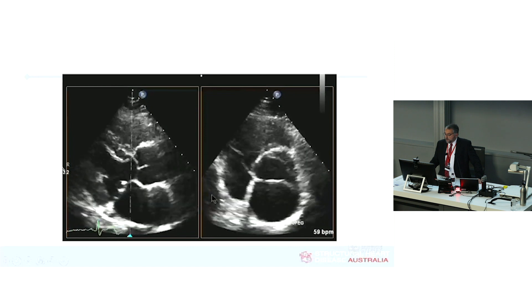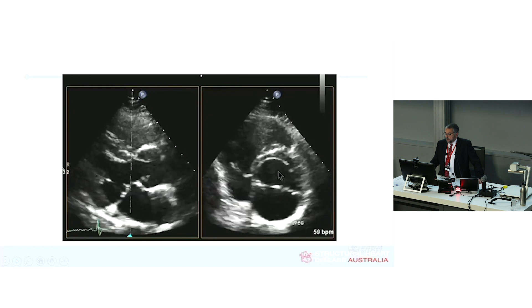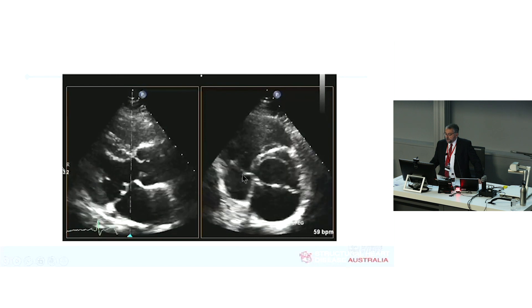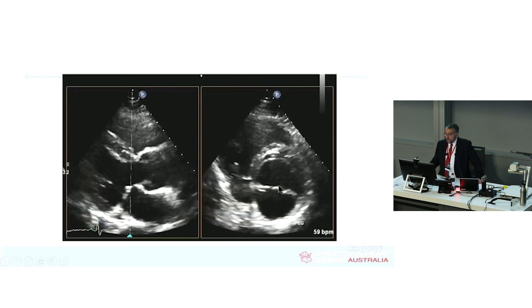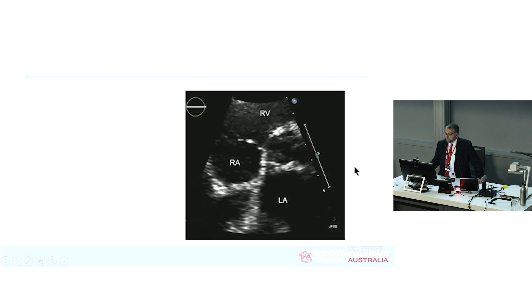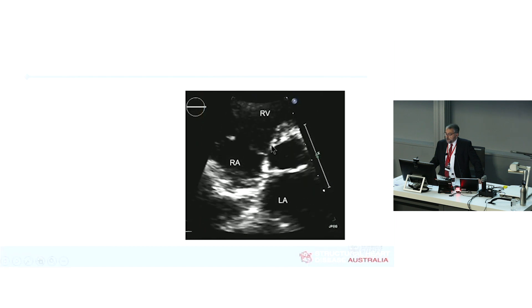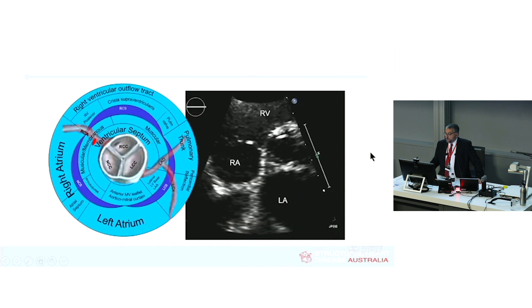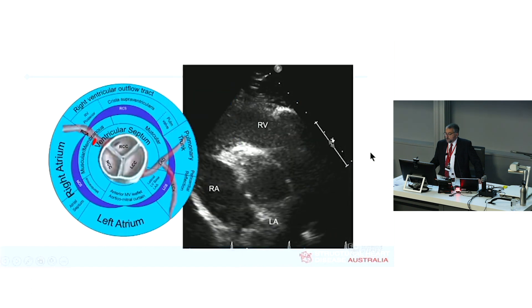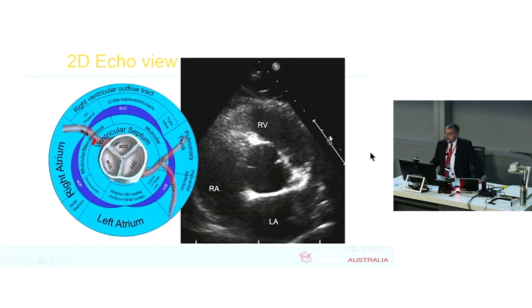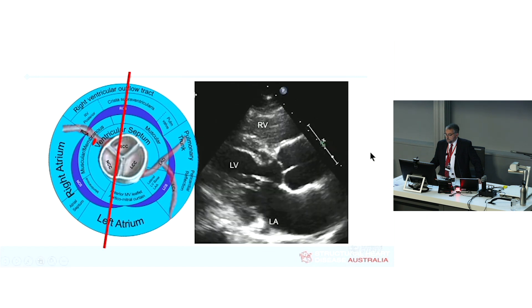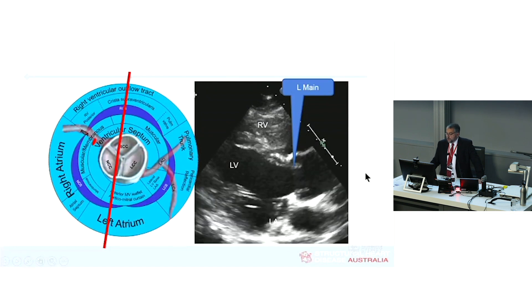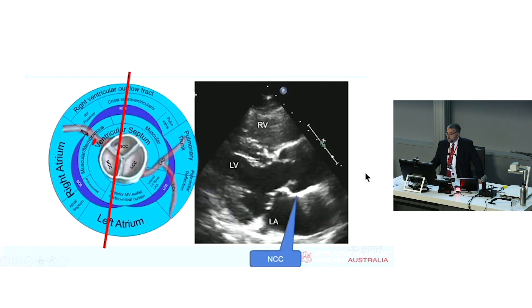This is a picture of X-plane looking at the parasternal long axis with a left ventricular outflow tract view from below on the right-hand side. The left ventricular outflow tract is made up of muscular ventricular septum and the aorticomitral curtain — the anterior leaflet of the mitral valve — it is not a standalone structure. With just a little tilting, you can bring in muscular septum, membranous septum, and the aorticomitral curtain. We're taught that in the parasternal long axis you see the right and non-coronary cusp, which is mostly true, but it wouldn't take much of a tilt to bring in the left coronary cusp.